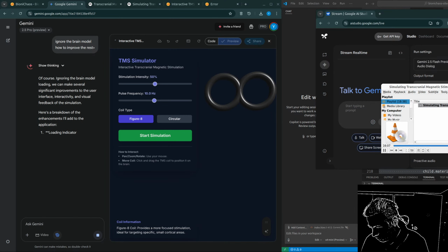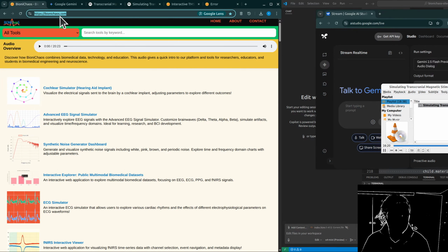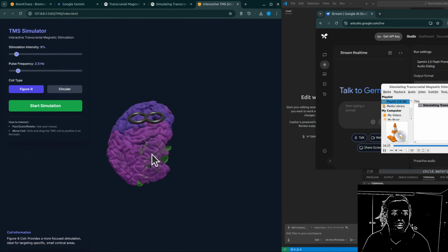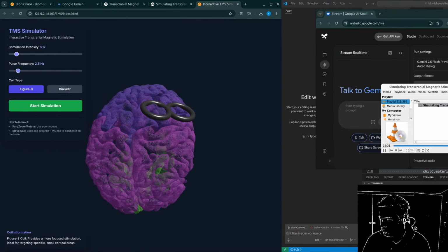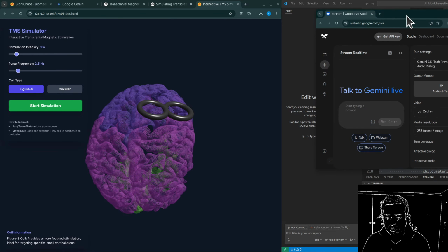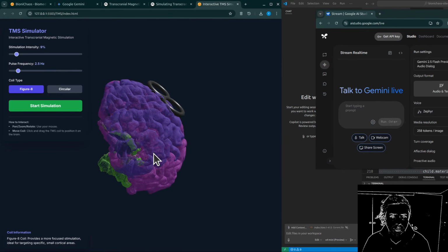Okay, so putting it all together now, we've really followed this fascinating journey. Started with building that detailed digital twin of the head, segmenting all the tissues, making the computational mesh, and then modeling the TMS coil, solving Maxwell's equations to map out that crucial E field distribution. Then diving into the neural realm, simulating how individual neurons might fire, how networks might react. And finally, trying to bridge that gap, however challenging, to predicting observable outcomes, validating with things like MEPs or comparing with EEG changes. What's the big takeaway then from your sources about the overall value of this incredibly multifaceted simulation process?